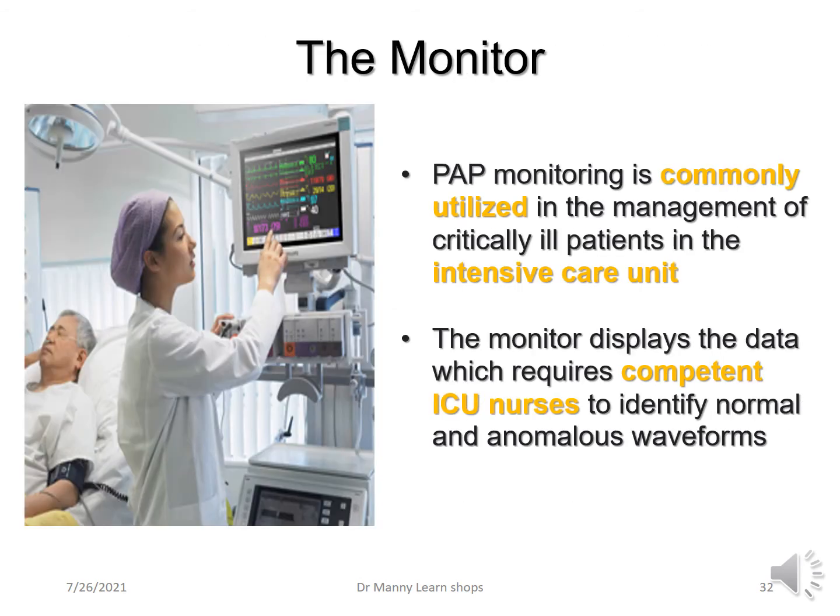Then you've got the monitor. The monitor is commonly utilised in the management, as we said, of critically ill patients in an intensive care, but it requires personnel who are competent, and typically this will be competent intensive care nurses who identify normal and anomalous waveforms.